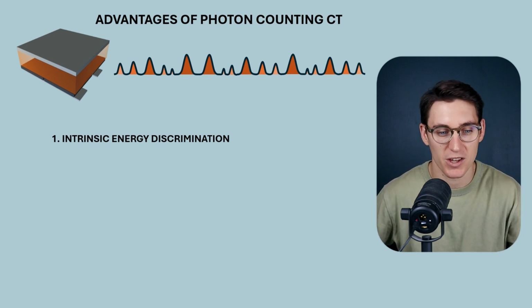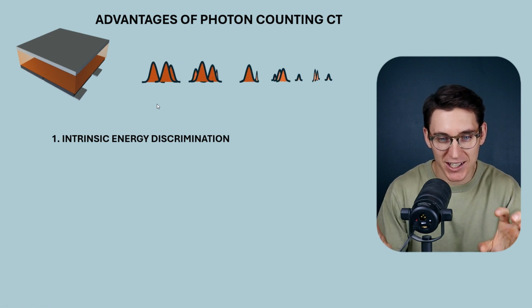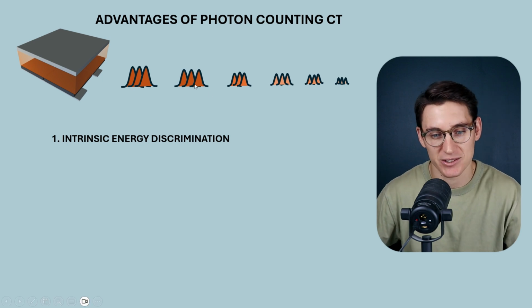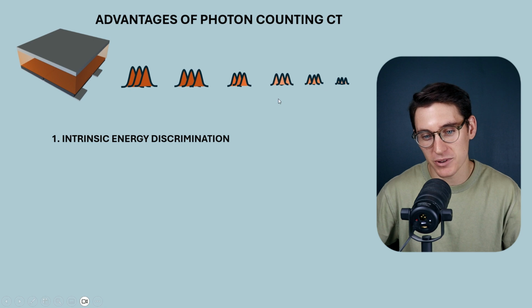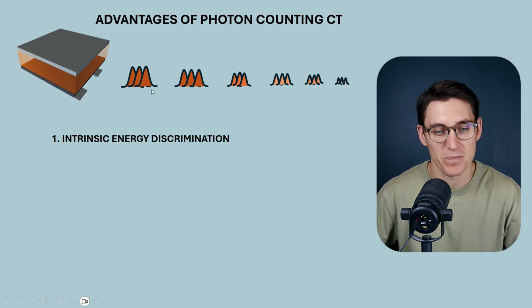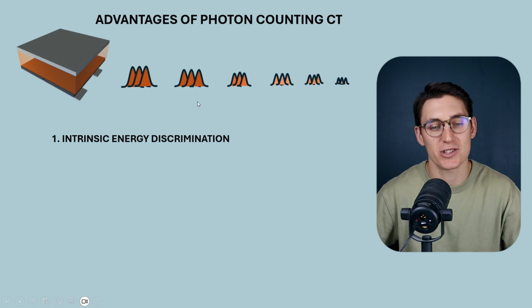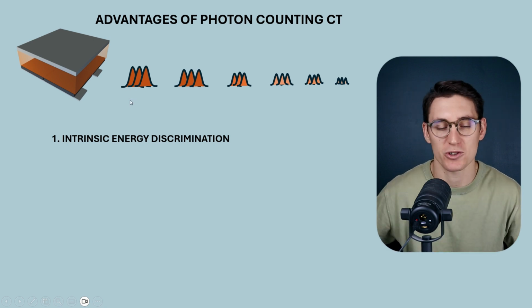But we only had two X-ray energy sources, and they were actually different X-ray spectrums heading towards the patient. What we can do in photon counting CT is separate each one of these X-rays into individual energy categories. Now we've not only got dual energy sources, we've got multiple energy sources depending on how well we can discriminate the different energy levels. And we can say we're only going to use the data from X-rays in this energy bin here and see how the tissues respond.